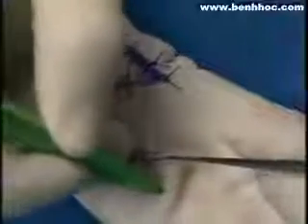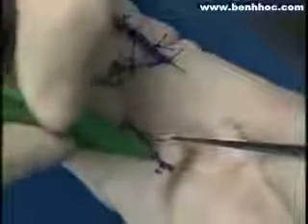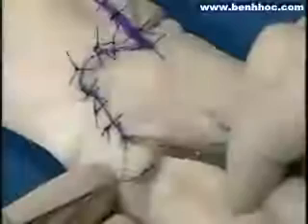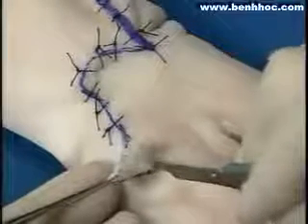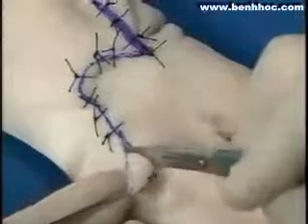Always place the hook at the apex of the dog ear and always cut away from the flap, so you do not want to interfere with the blood supply. The back cut is now made. We can see using the hook that we have excess, and this excess is now trimmed off, removing the dog ear and allowing the flap to inset nicely into the area of the defect.